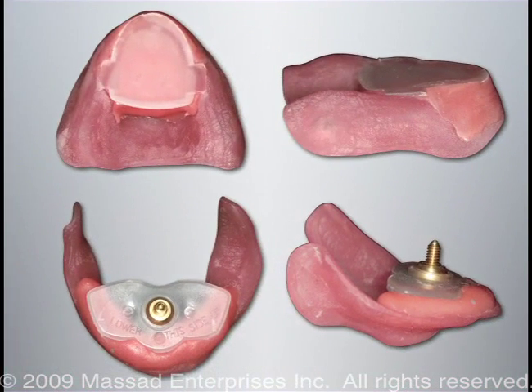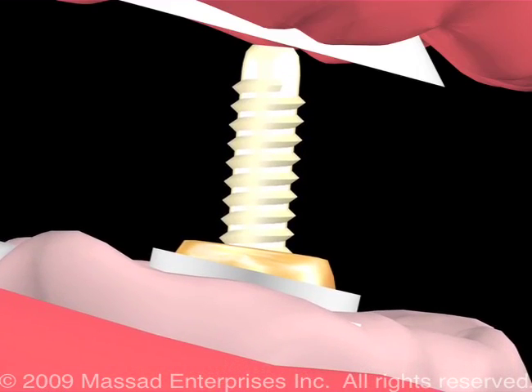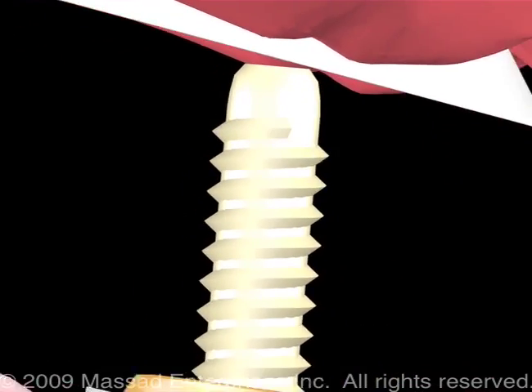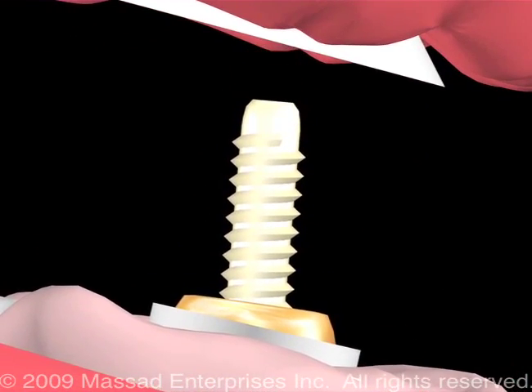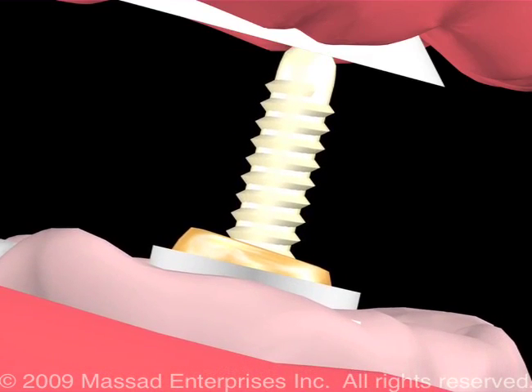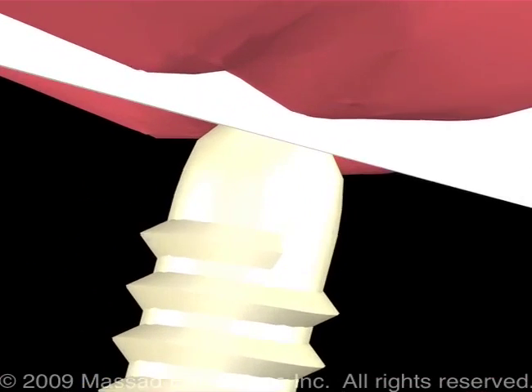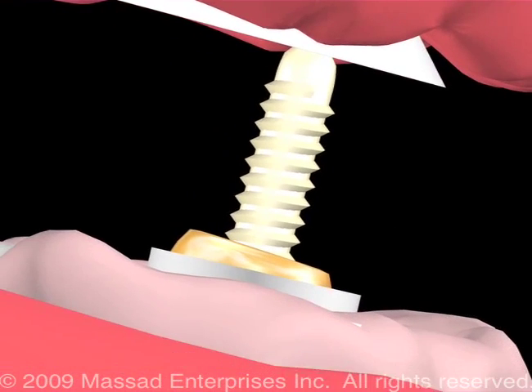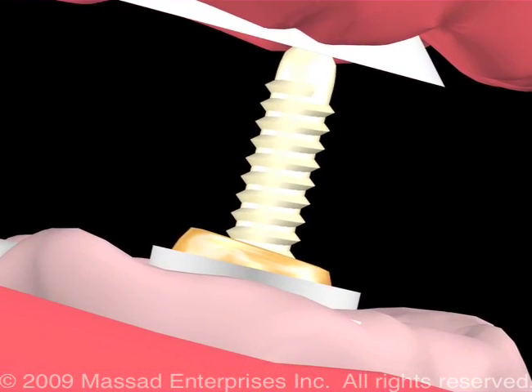Here is another view of the jaw recorder device after mounting is completed. Note that if the pin touches the striking plate at the incorrect angle, the practitioner can then rotate the pen either anterior, posterior, or laterally in order to align the dome of the pen to the plate in a perpendicular position. Note the top of the pen dome should contact the striking plate perpendicularly.